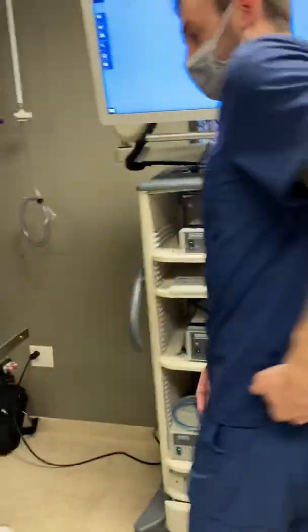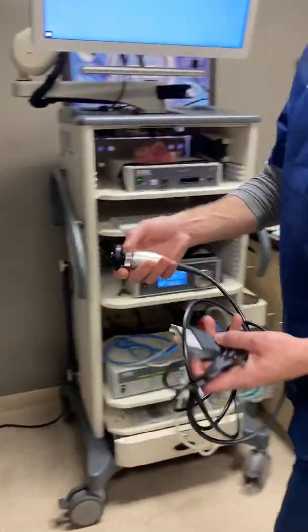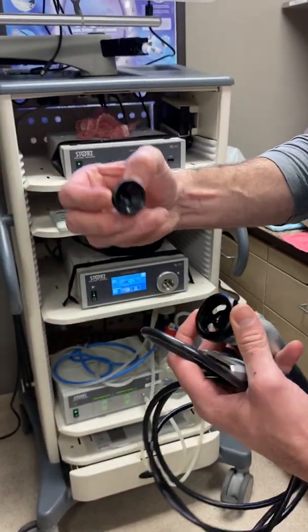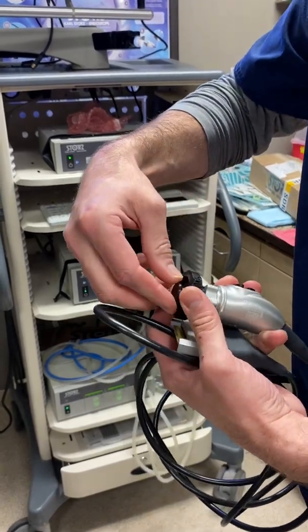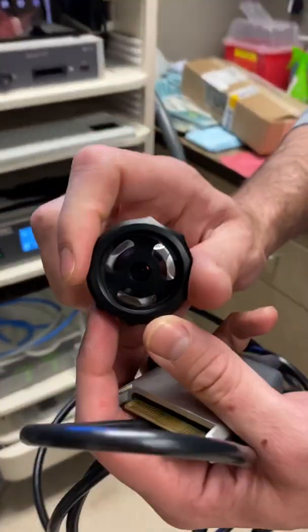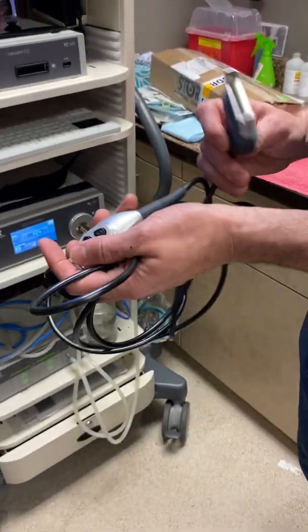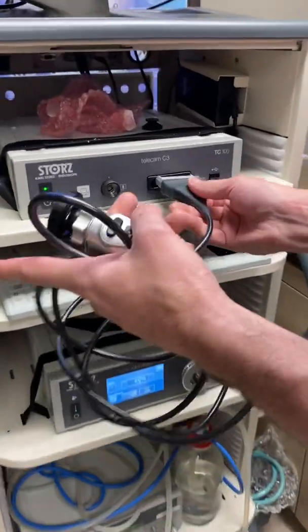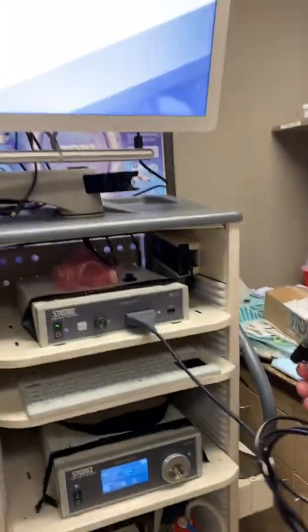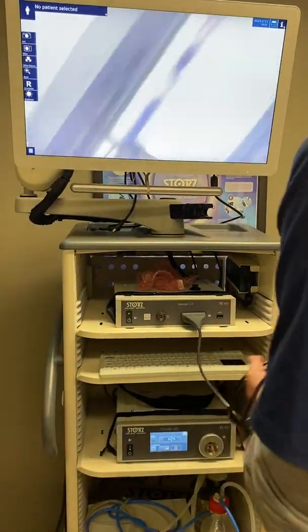There are a few components to the system beyond the boxes. The first is the camera head — an HD camera head. There's a little protector for the scope lens so it doesn't get scratched or damaged, so make sure you take that out before you put the scope in by twisting the coupler to release it. This is also how you insert the endoscope. It goes into the top box — push it straight in, you'll hear it click.